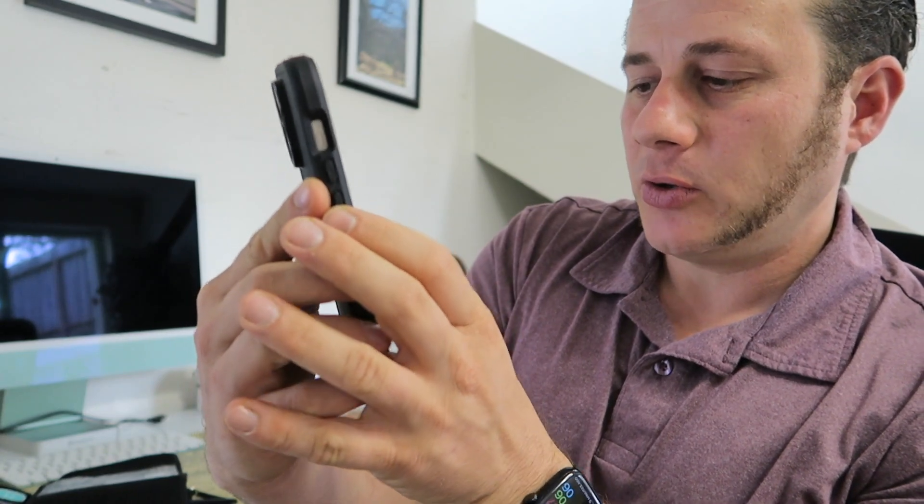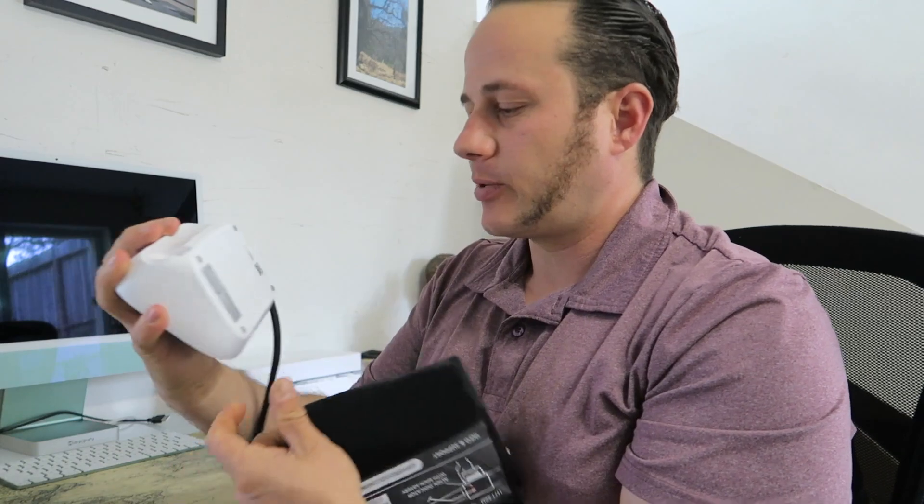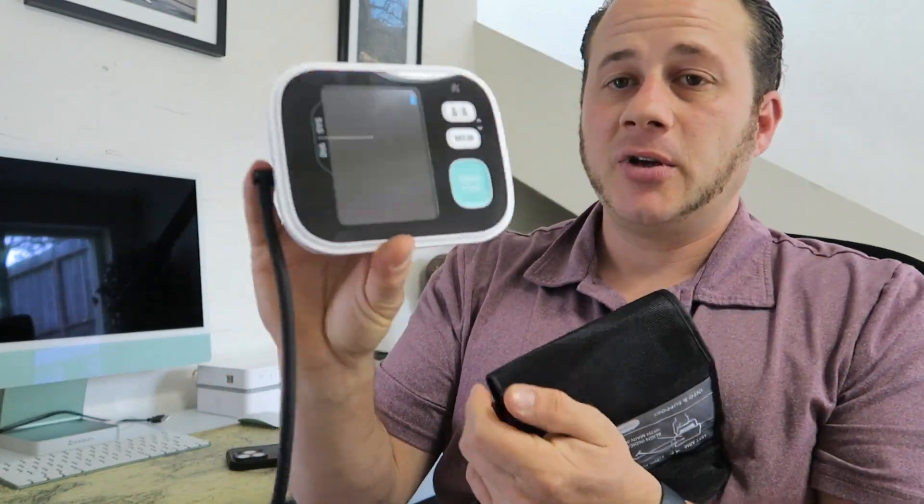I still have a lot of work to do, but I hope this video helps you make a decision. I definitely recommend this blood pressure monitor — it's just a great tool to have to make sure that you stay nice and safe.